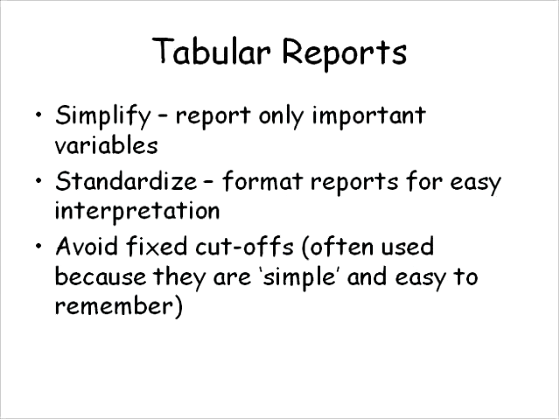Let's move on and talk a little bit then about, once we've performed our spirometry, lung volumes, and total lung capacity measurements as indicated, how's the best way to present that data? I would suggest to you that, again, in terms of keeping things simple, what we should include on our final report should be just those tests that are related to the questions to be answered. That would include spirometry, diffusing capacity, and perhaps the total lung capacity or other lung volume subdivisions, if in fact those are going to help to provide a diagnosis. Again, the guideline here is to avoid misclassification. So in order to standardize for easy interpretation, our reports should be as simple as we can make them.